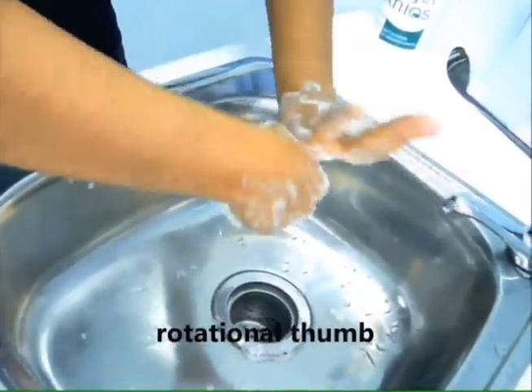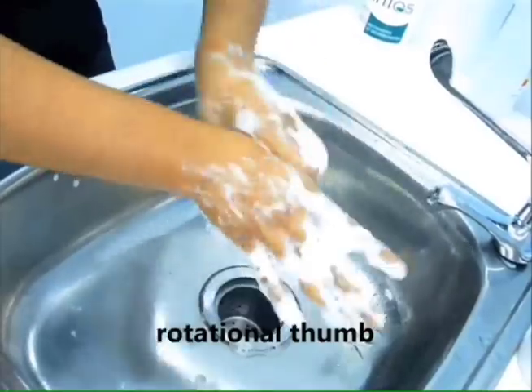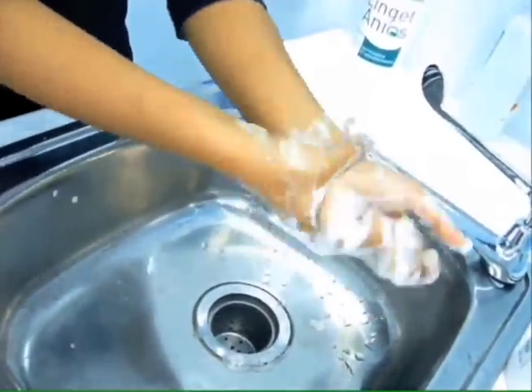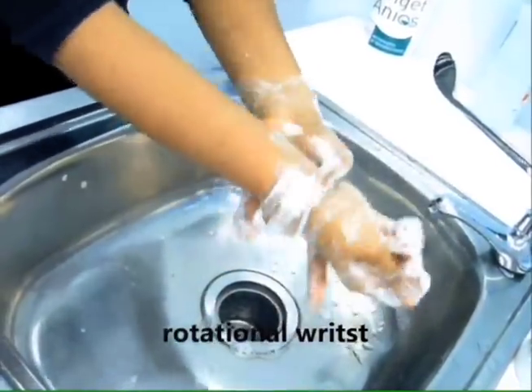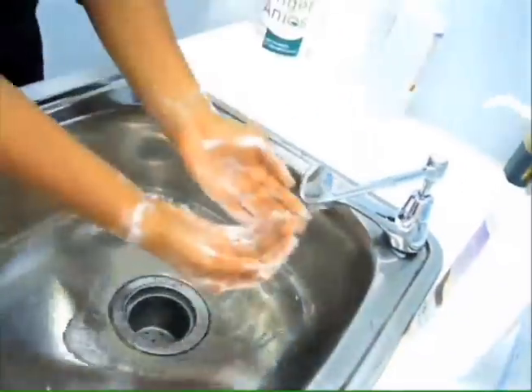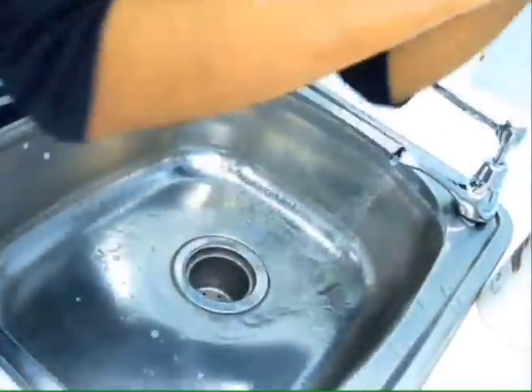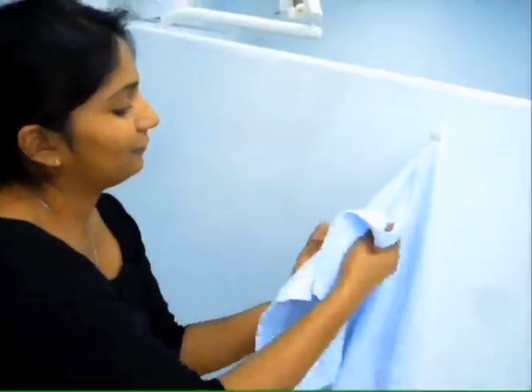Scrub finger tips while keeping fingers interlocked. Scrub each thumb clasped in opposite hand in a rotational movement. Scrub each wrist clasped in opposite hand. Dry hands with a clean towel.